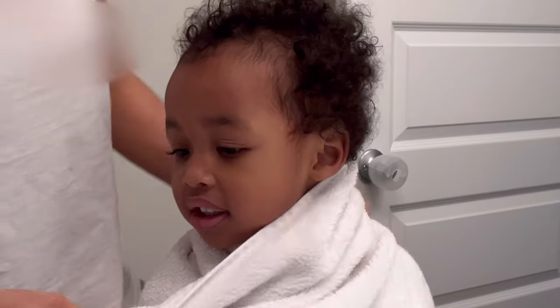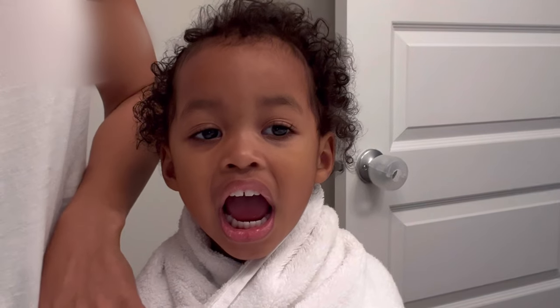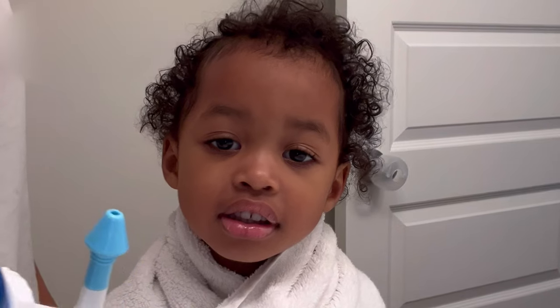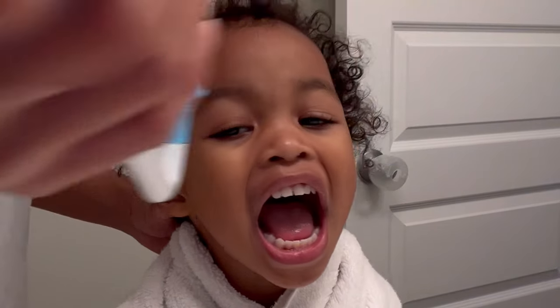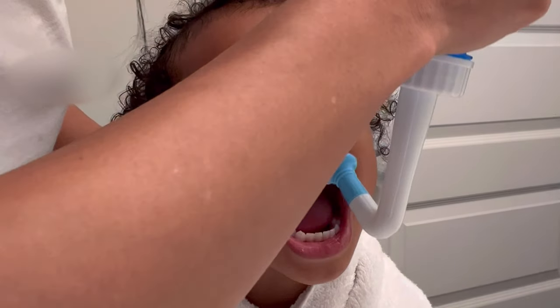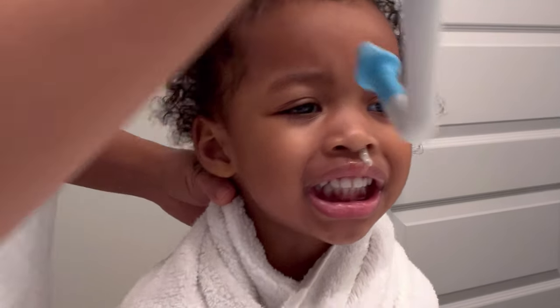Ready? You're gonna open your mouth for mommy. We're gonna sweep the water inside your nose, okay, and then it will flush out the other side. Ready? Open your mouth, good job, lean forward. Good. Mommy's gonna go a little bit first to let you feel okay. Three, two, one. How's that?